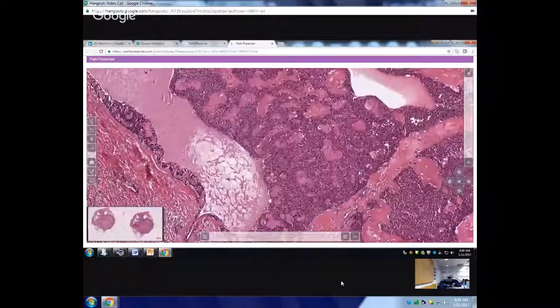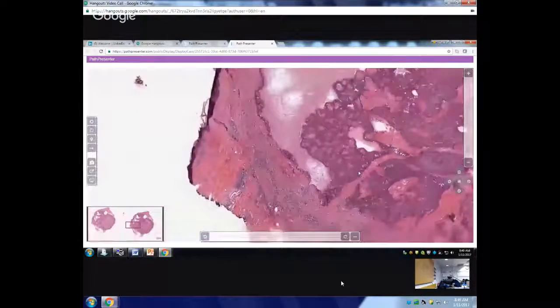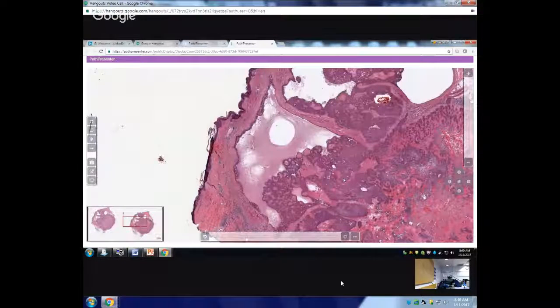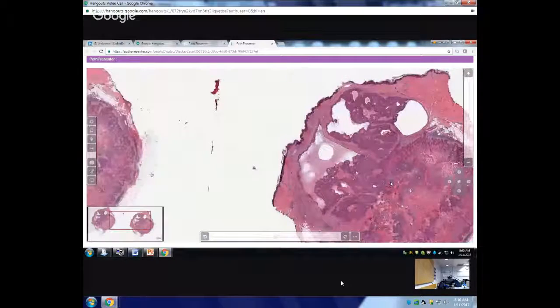So a nodular and cystic neoplasm, mostly in the dermis, composed of basaloid cells, can have admixed clear cells and mucinous cells, and then very sclerotic stroma. And then the other thing is the admixed ducts actually. So that is a nodular hidradenoma.